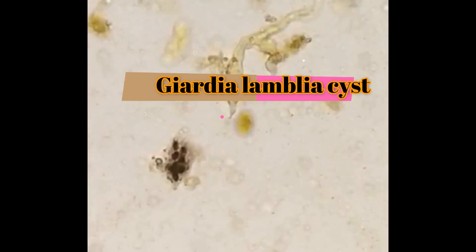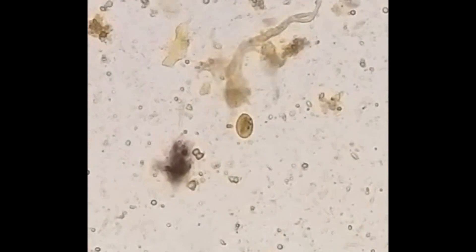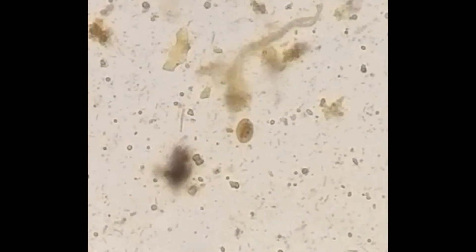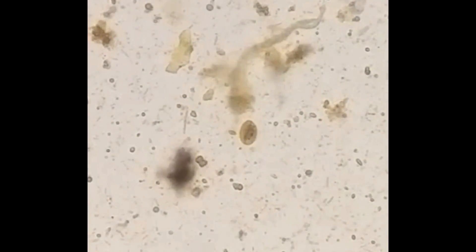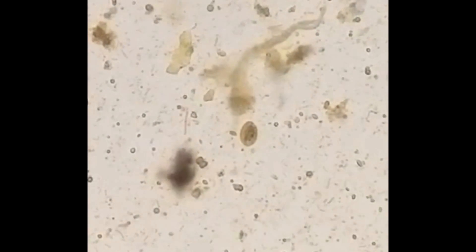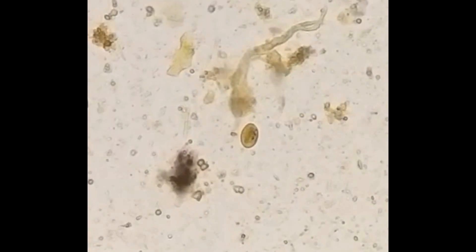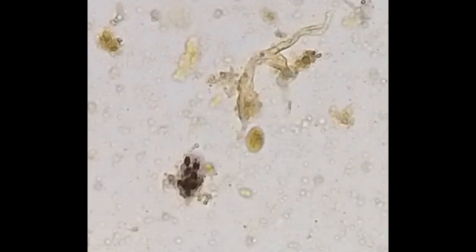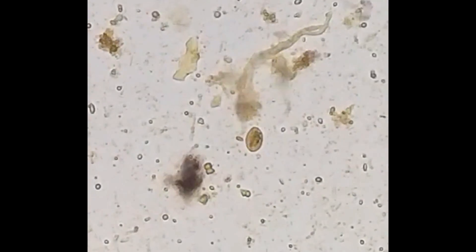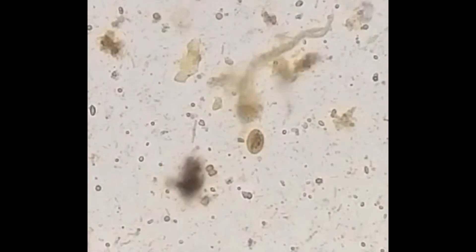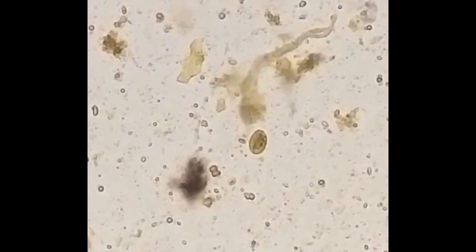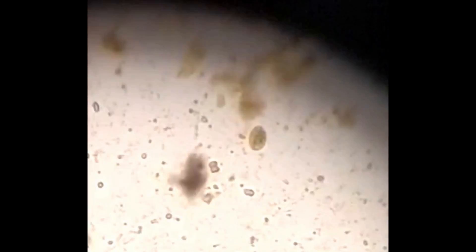Here you can see a Giardia lamblia cyst. In the center of the cyst you can see hair-like lines folded in a 2-S shape. The cytoplasm is clear pale yellowish color. It has 2 to 4 oval nuclei. The cyst has an oval shape and size is 8 to 12 micrometers.